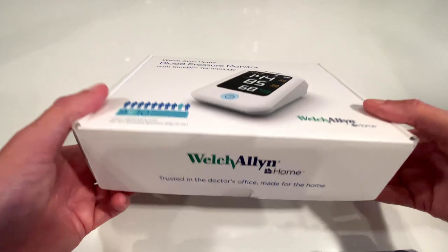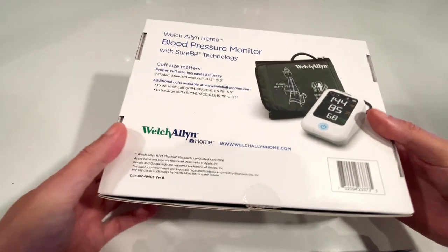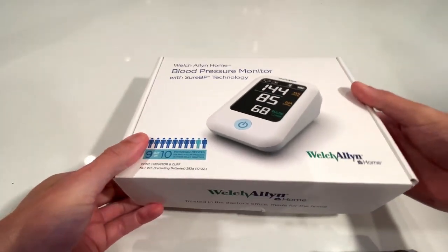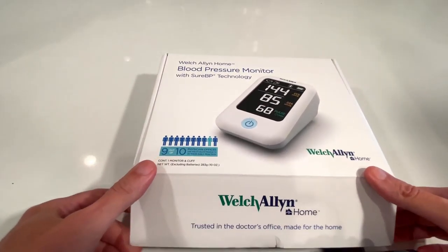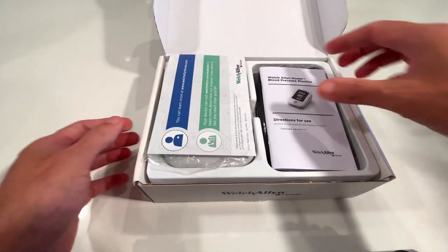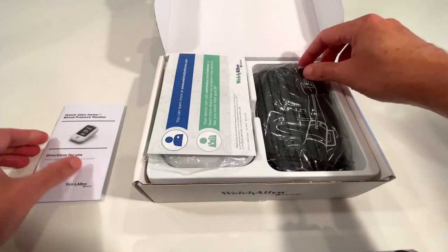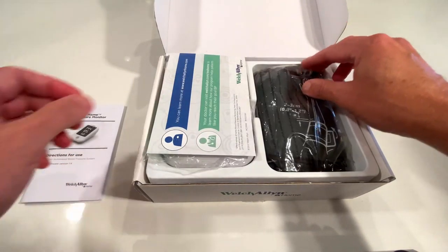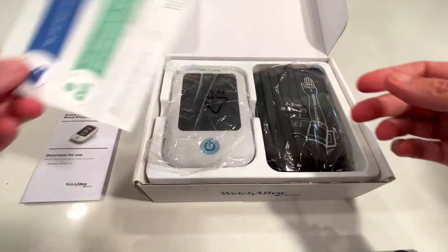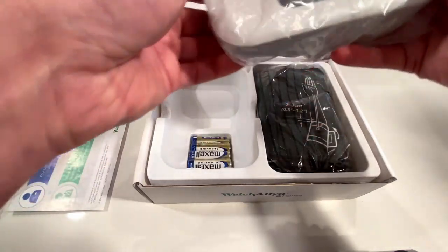I already have one myself. This is one that a friend purchased and lent to me so I can make this video. This is the box that it comes in. They have two compartments — on the right you'll see the instruction booklet and the blood pressure cuff itself, and on the left they have an informational leaflet and the monitor comes in a plastic bag.